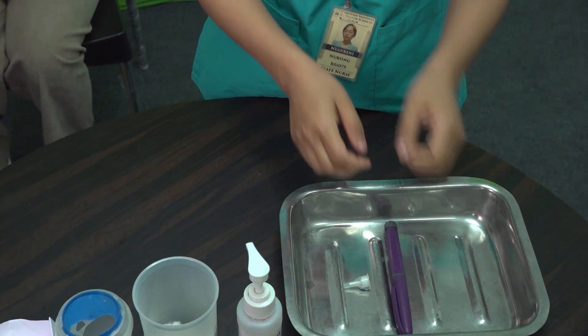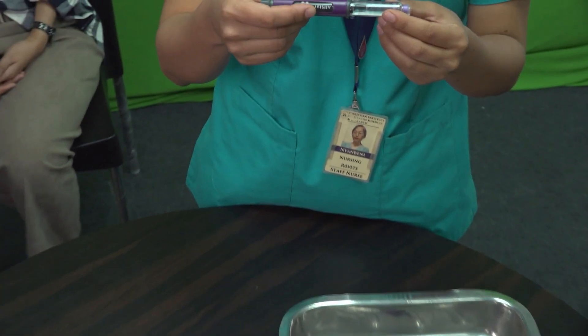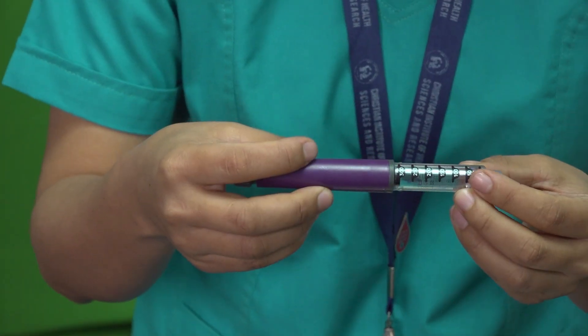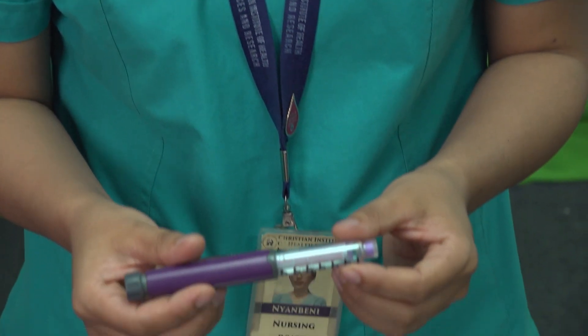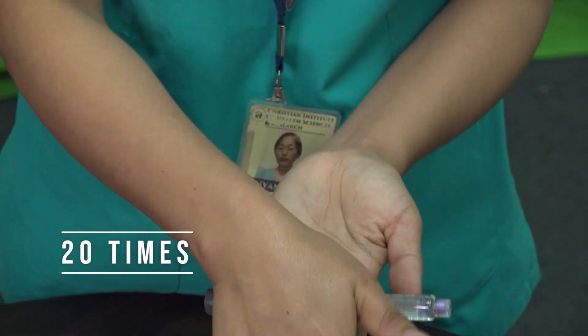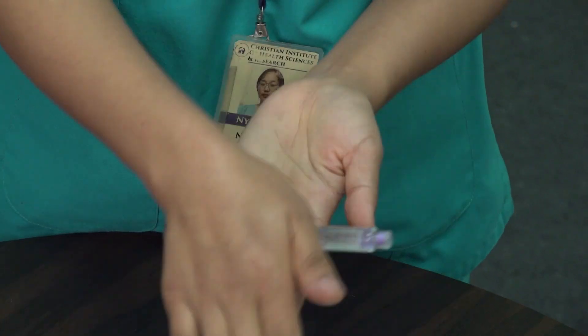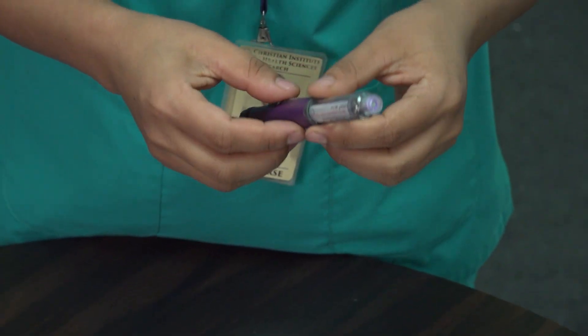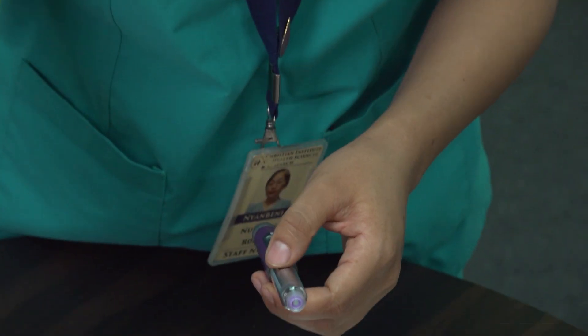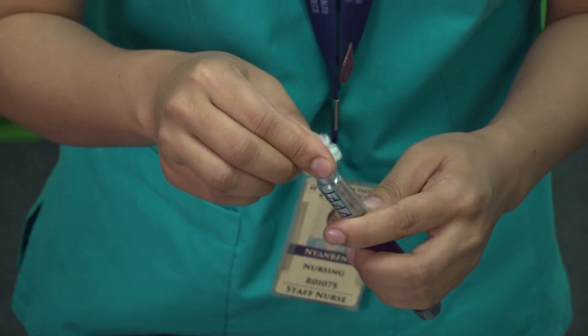Check the insulin cartridge for clumps, discoloration, or crystals — do not use it if it appears unusual. Gently roll the insulin cartridge between your palms to mix the insulin evenly. Disinfect the rubber stopper of the cartridge using an alcohol wipe or cotton ball.